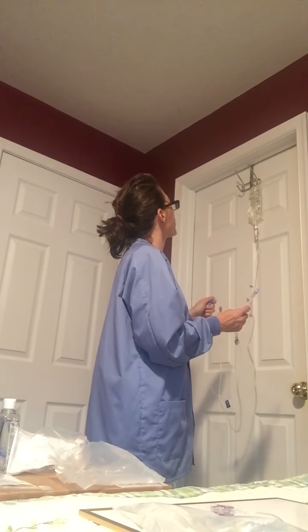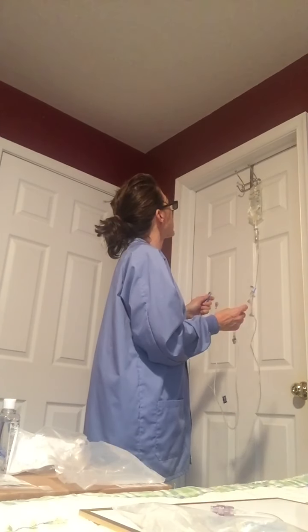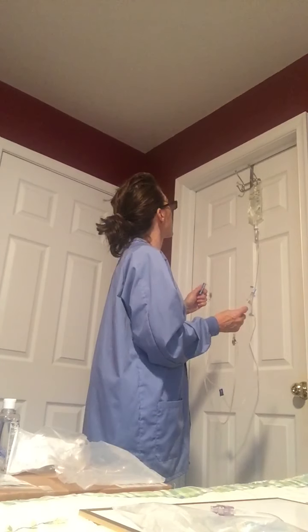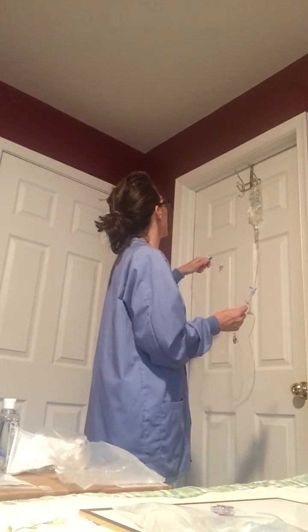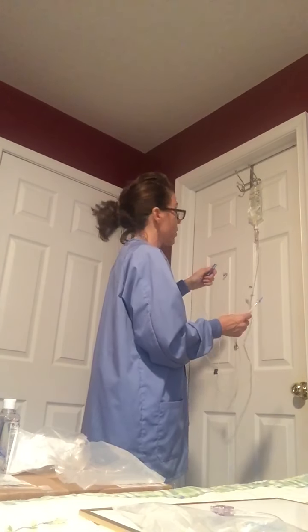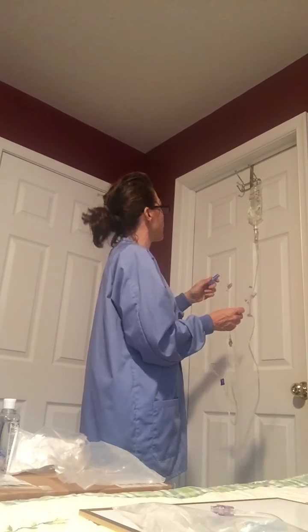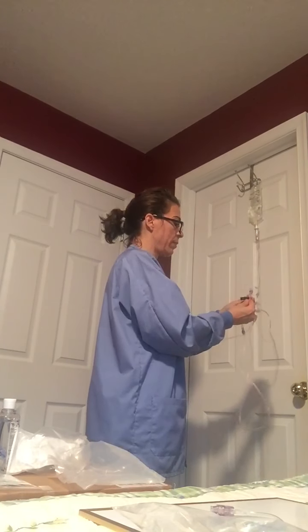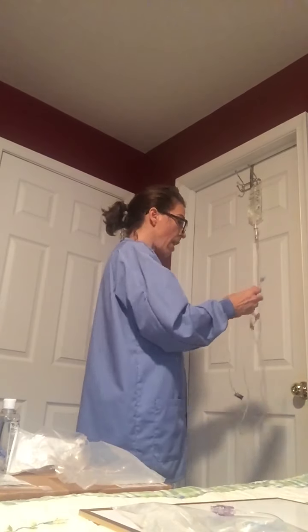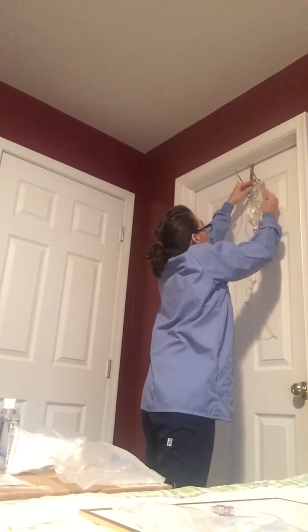I would have my watch, and I would watch for 5 drips in 15 seconds. I think I need to speed it up a little bit more. Okay, so I have it set: 5 drips, 15 seconds. So I'm going to go ahead and close the drip clamp. The roller clamp is on because it's set for my 20 drips per minute, but the drip clamp is on.